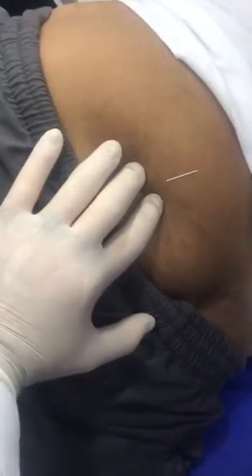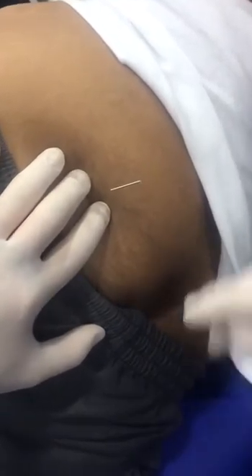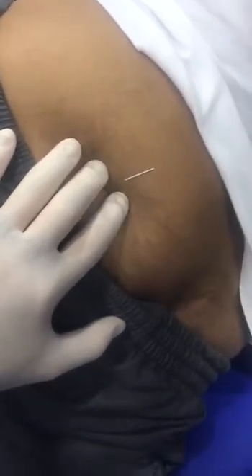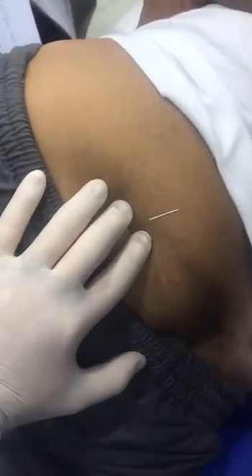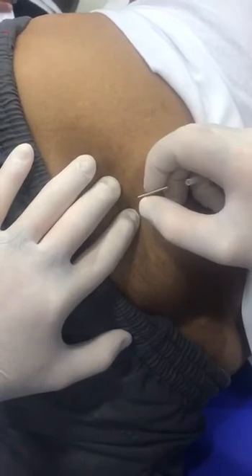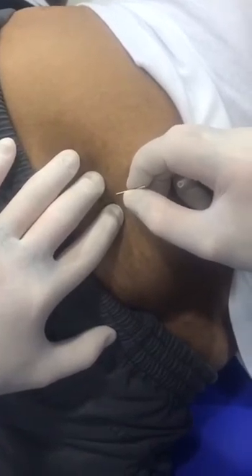Have you realized that I haven't changed the direction and it was giving electricity? So in this case I will change the direction. I'm going to change it. But this is strange, because if I have gone through, there is no electricity, and I repeat the direction, it's a bit strange. Sometimes they are because of trigger points, but he's a physio, so he knows.